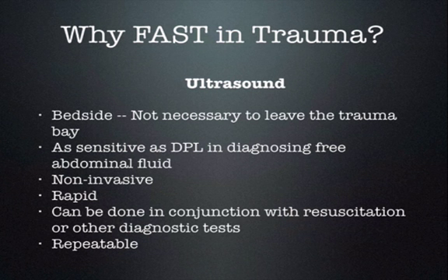Ultrasound, in contrast, is done at the bedside, so it is not necessary to leave the trauma bay. It's as sensitive as DPL in diagnosing free fluid, but it's non-invasive. It's also rapid, can be done in less than a minute, and can be done in conjunction with other resuscitation or other diagnostic tests. Further, it's repeatable, so if the patient's condition changes, the patient becomes hypotensive, you can repeat it to see if the patient now has free abdominal fluid or bleeding into their abdomen.